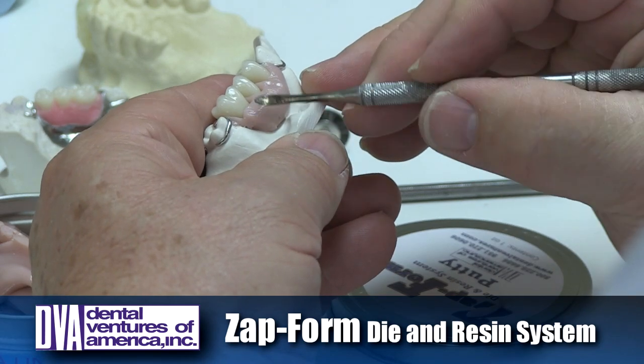All you have to do is remove the appliance. The teeth stay in the acrylic, and the acrylic doesn't stick to this material. The teeth come out real easy — they just pop off. This is a technique I hope you'll find will save you some time and make you some money. No boil out, right at the bench. It's easy, it's fast, and I actually enjoy doing partial dentures now because I wind up making some money.